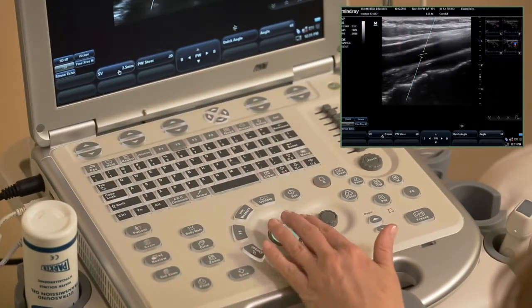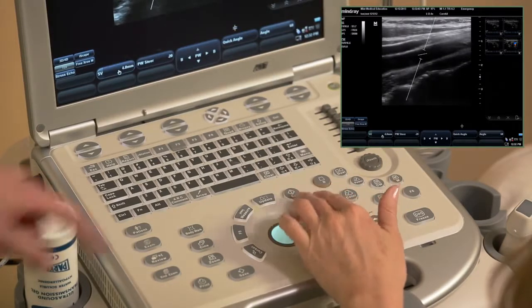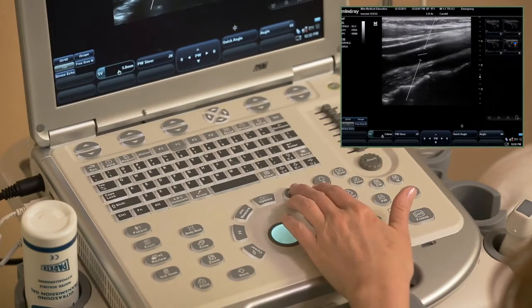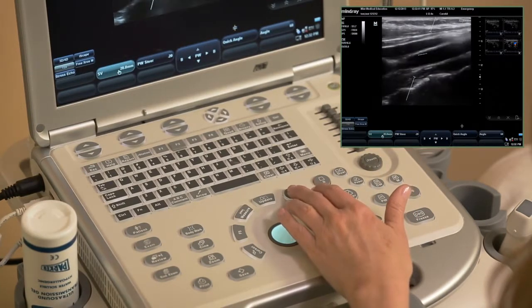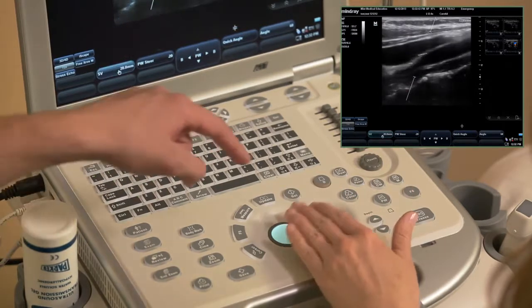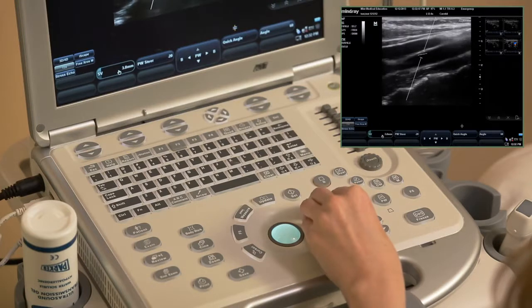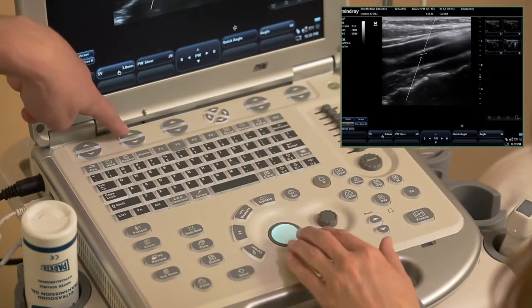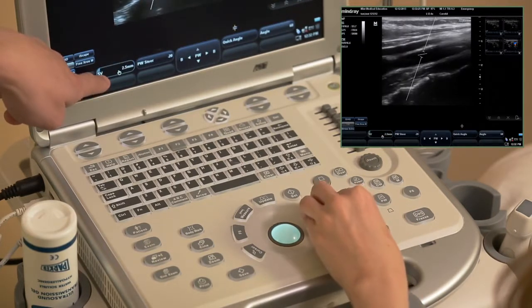We had discussed that a little bit, but if you're tuning in for this chapter, you want to know that that cursor allows you to get your little pointer, your mouse sort of thing, and you can move that down to the sample volume and adjust it using the set key or also using the rotary navigation key, multifunction key, and you can see that you're getting smaller as you go counterclockwise. You can also use the soft keys to manipulate the sample volume, again, the SV.